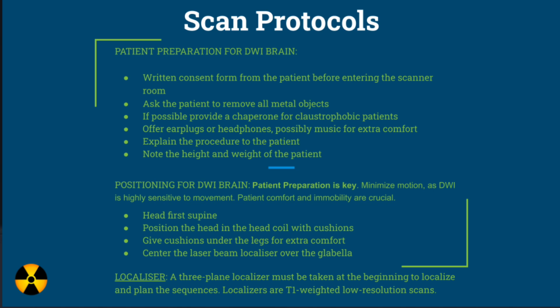We will ask the patient to remove all metal objects. If possible, we'll provide a chaperone for claustrophobic patients, offering earplugs or headphones or possibly music for extra patient comfort. We will explain the exam procedure to the patient. Also note the height and weight of the patient if the exam includes MRI contrast.